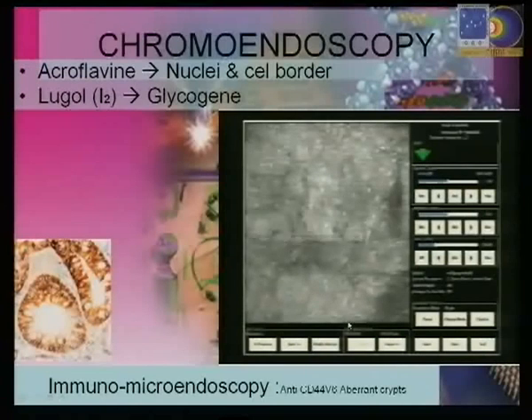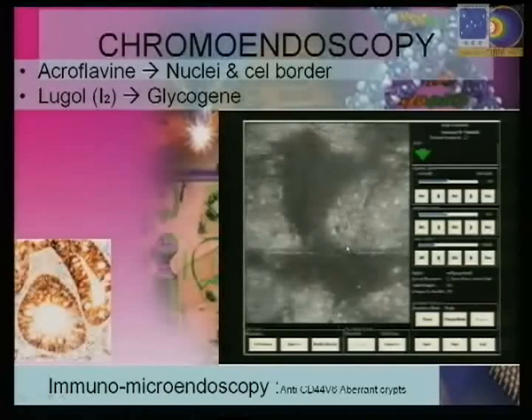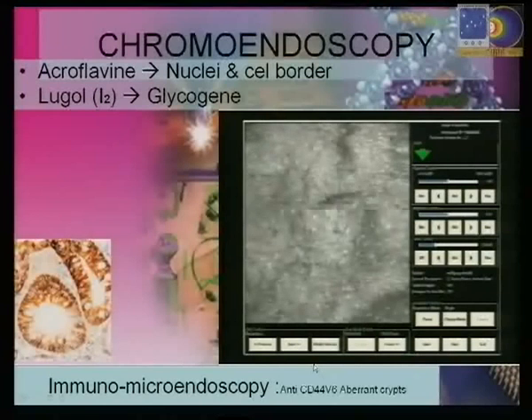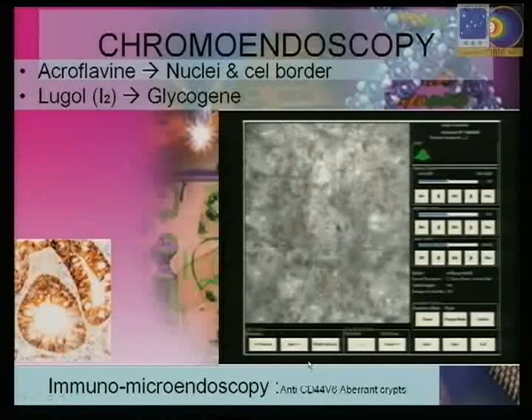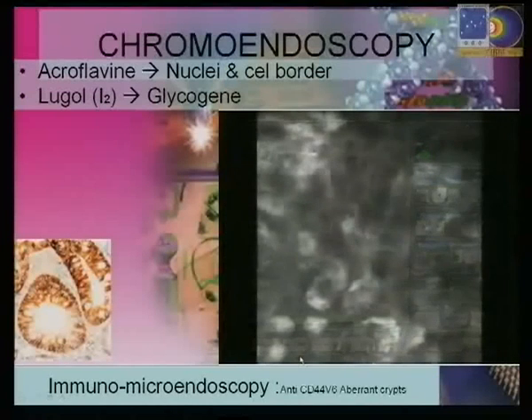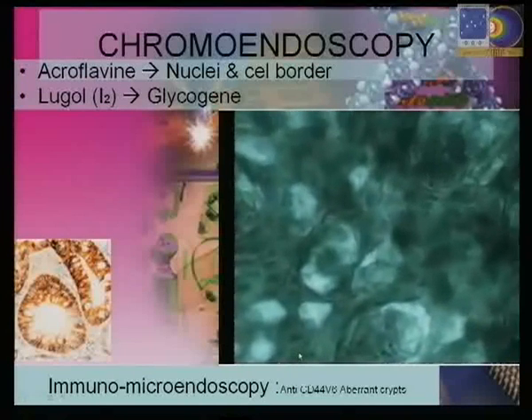Confocal images are displayed every 0.8 second. The number of moving artifacts can be minimized by gentle pressure of the distal tip of the endoscope onto the mucosal surface and by continuous suctioning. After stabilization is reached, suspected areas can be imaged over the whole imaging plane depth. Here, irregular cell architecture indicates squamous cell carcinoma. The different confocal images can be digitally captured with the help of a foot pedal. Online obtained images can also be reassessed at any time after the procedure.